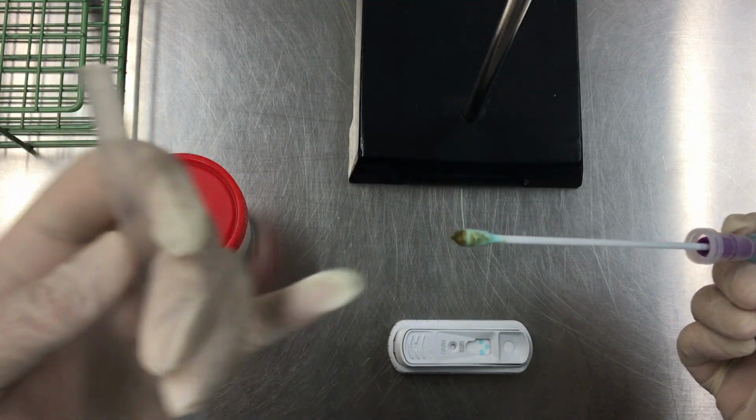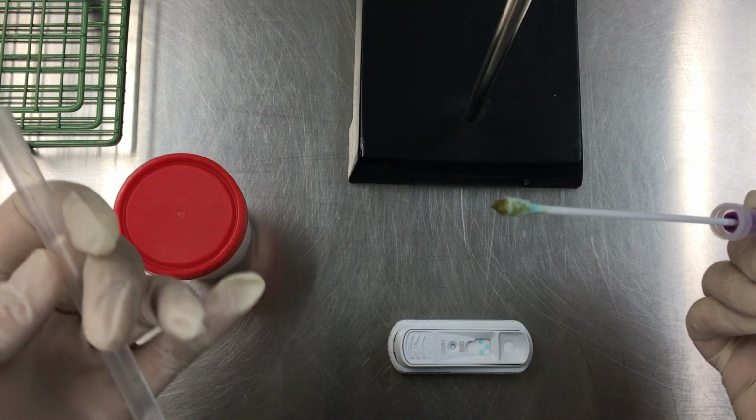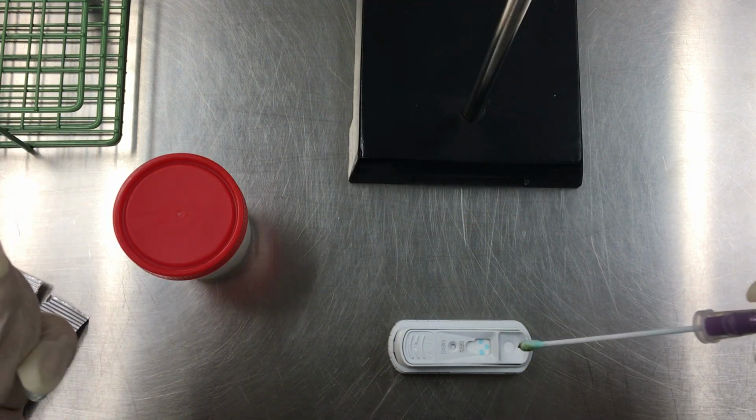And this sample is feces, which is brown, and there's 5 letters in the word brown. So this test requires 5 drops into the sample well.